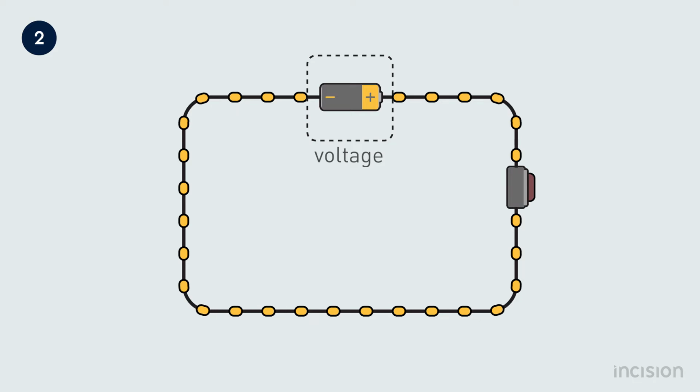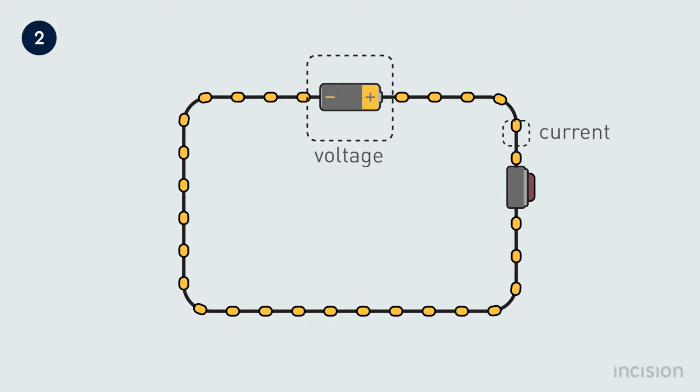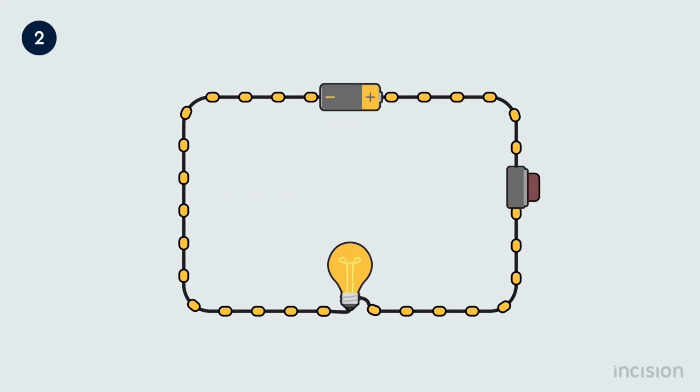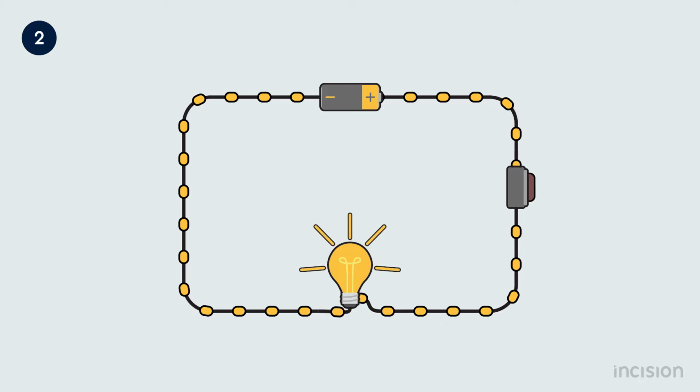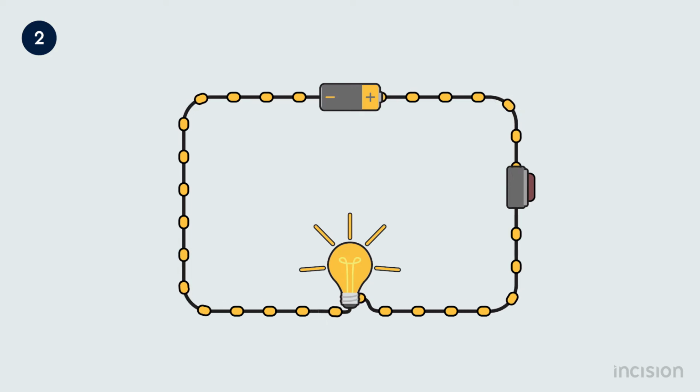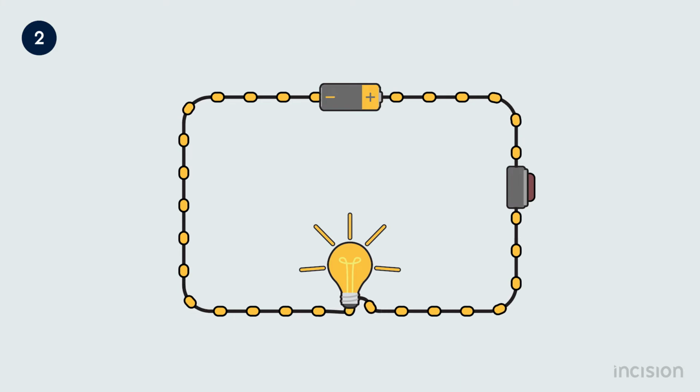Instead of a flow of water, the result is a flow of electrons, called current, expressed in ampere. Whether the water will flow around depends on the pump's ability to create a pressure difference and the resistance within the circuit. For example, narrowing a part of the water's tube results in resistance, limiting the water's ability to flow. With electrical resistance, expressed in ohm, the electrical energy is transformed to different forms of energy, such as heat or light. An example of such an electrical resistor is the luminous part of a light bulb.